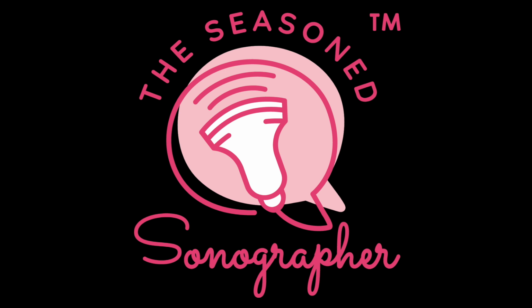The best approach for first trimester dating scans is transvaginal. It provides a better resolution. It's ideal for the pregnancies that are less than 10 weeks. You can see, after 10 weeks, you can see pretty good abdominally, depending on maternal habitus, but we always just look vaginally, cut to the chase, and start vaginally.